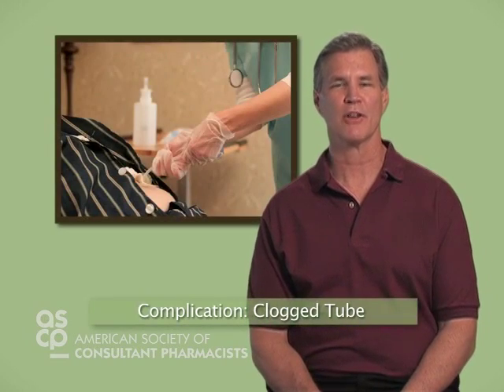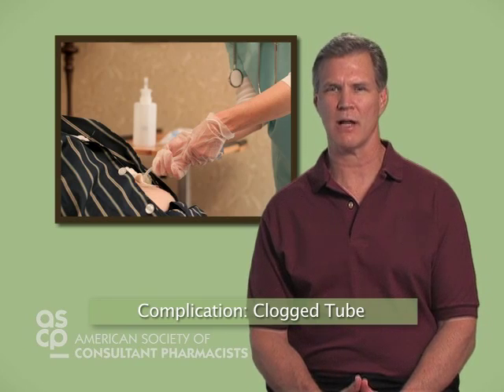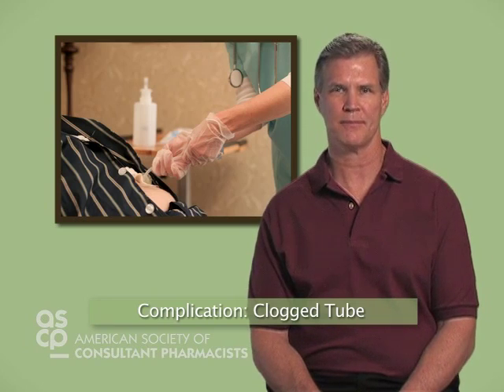Number 1, the clogged G-tube. First, check for the obvious, such as a kink in the tubing. The nurse may try to release a clog by gently milking the tube, followed with a flush of warm water. If there is no kink and milking the tube does not release the clog, follow your facility policy for clogged G-tubes. Never attempt to release a clog by using anything rigid or attempting a forced flush.